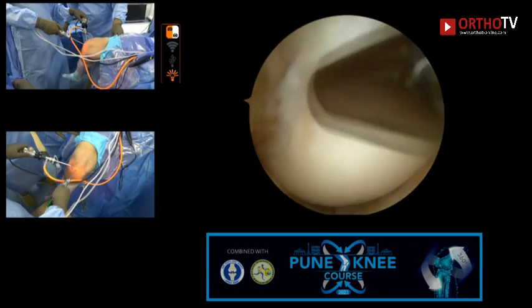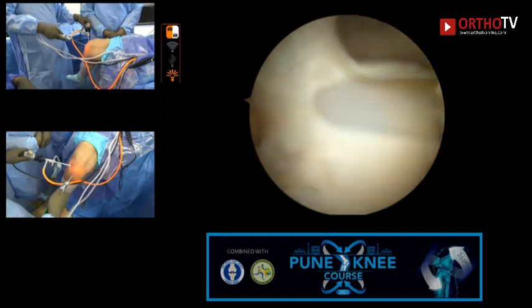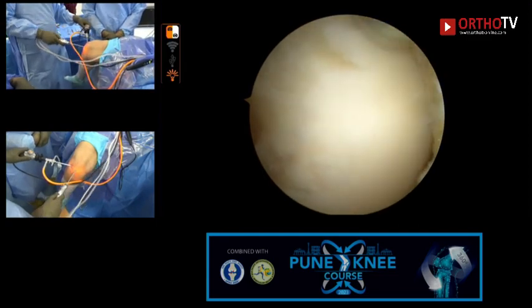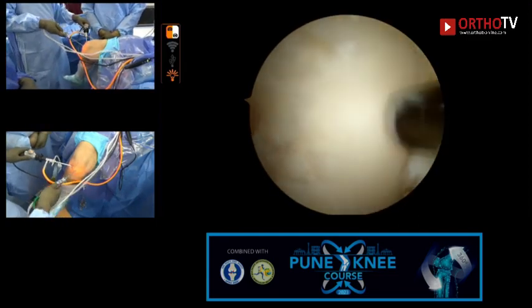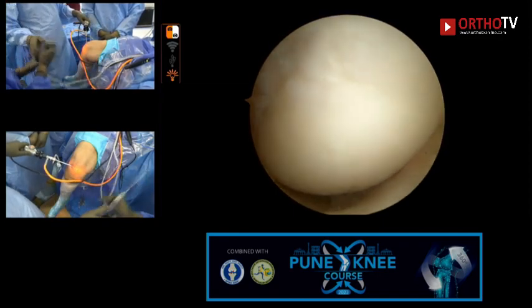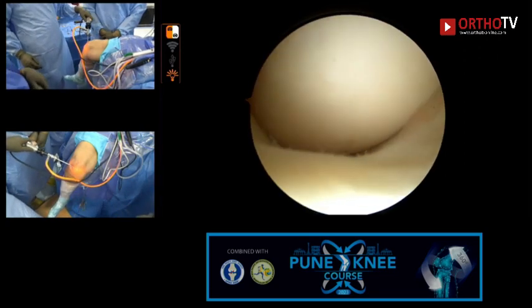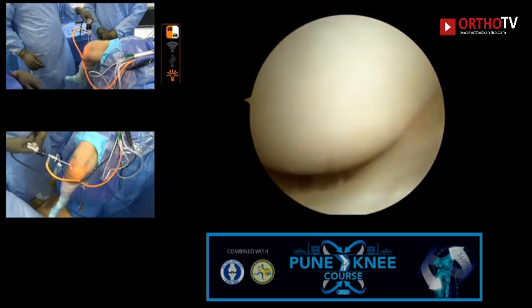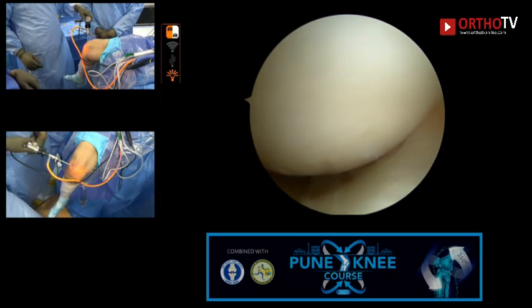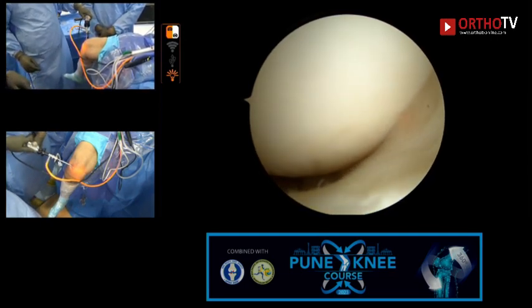So one of the things, I see Dave just passed the sutures. I always make my incision to collect the sutures before I pass them. The problem is if you've got a series of sutures coming through the skin, when you make your incision, it's very easy to cut through the sutures. Yep. And then you want to cry. But the problem is it does mean I make perhaps a bigger incision than I need to. So there's pros and cons to that.